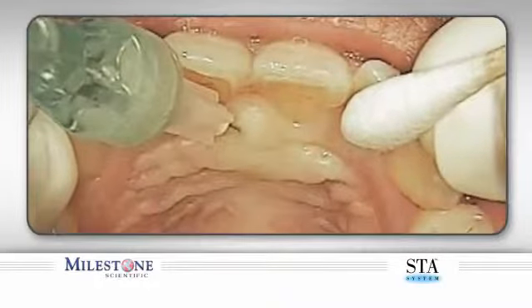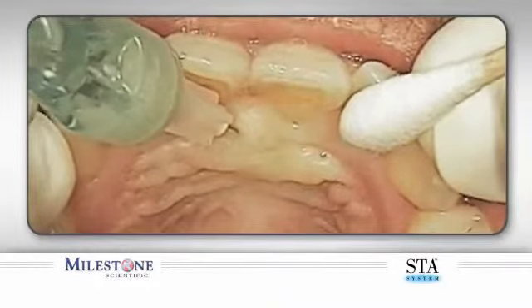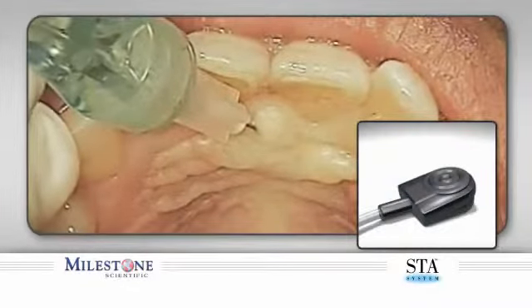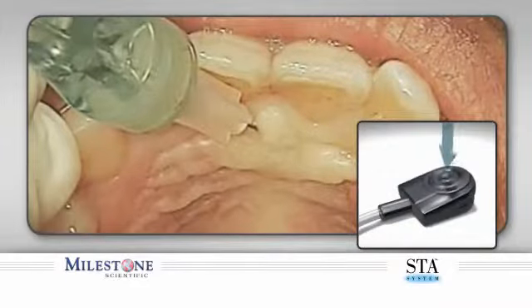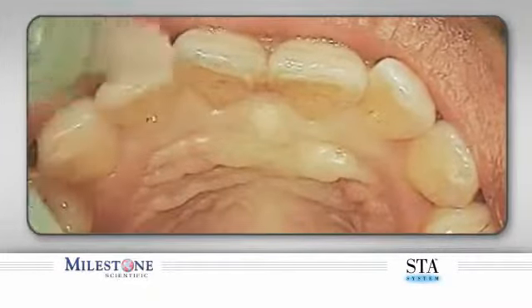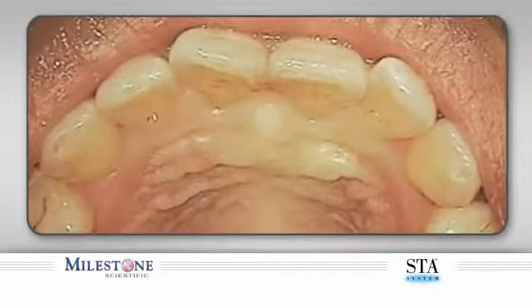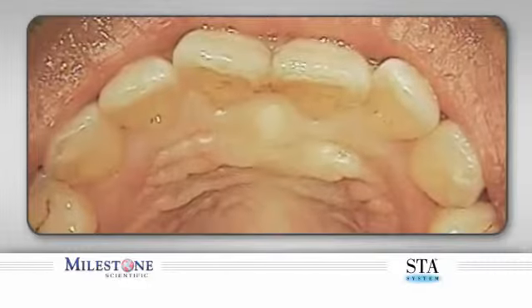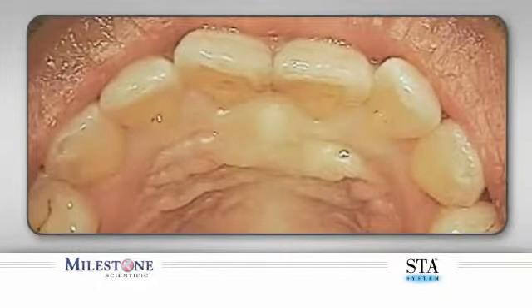To avoid anesthetic sprayback during needle removal, use the following removal technique. While the needle is still embedded in the patient's tissue, depress and release the foot control pedal. Count 3 beeps after releasing the foot control, and then totally remove the needle from within the patient's mouth. Direct the needle away from the patient, as a small amount of anesthetic solution may still be present.